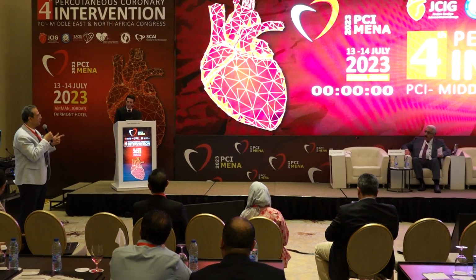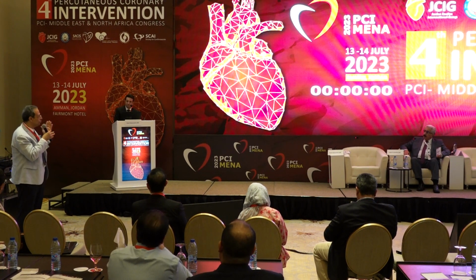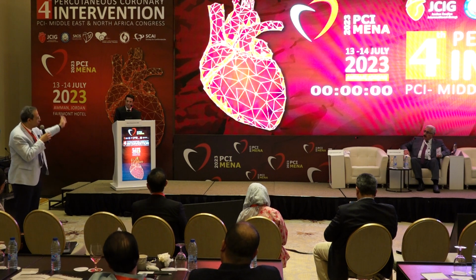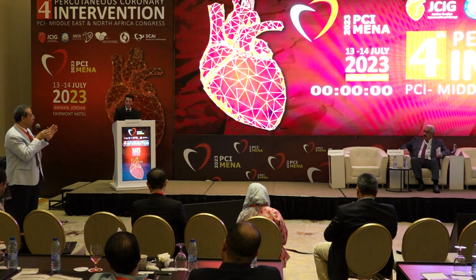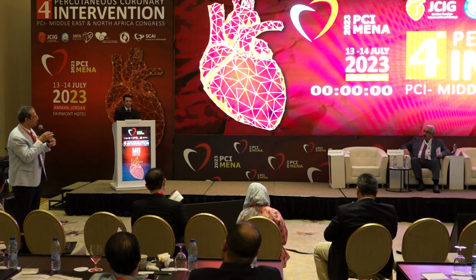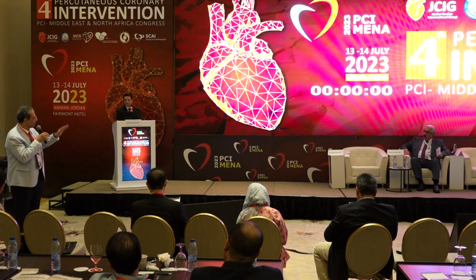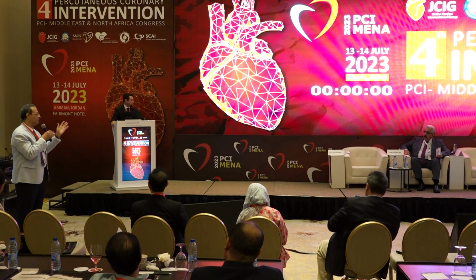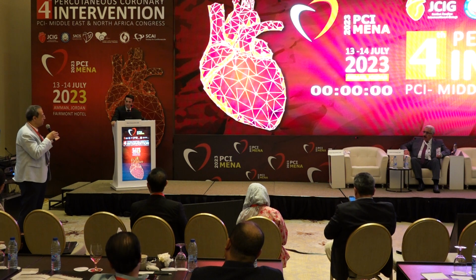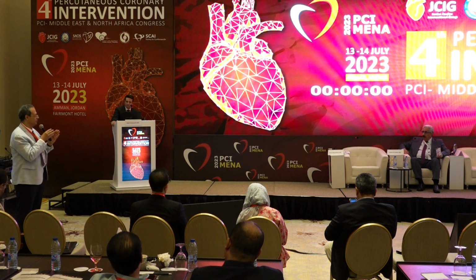Number two is if you are not sure, with very long lesions as in some cases, and you cannot decide where to go antegrade, you would go a long journey to reach this very long lesion. So sometimes we can use the retrograde wire as a marker. You can complete the case antegrade, but you need a marker to be sure that this is the connection, the lumen that you can connect. Number three, definitely failed trials from antegrade with an expert procedure, you will start retrograde. So these are the important three points that you need to start retrograde.